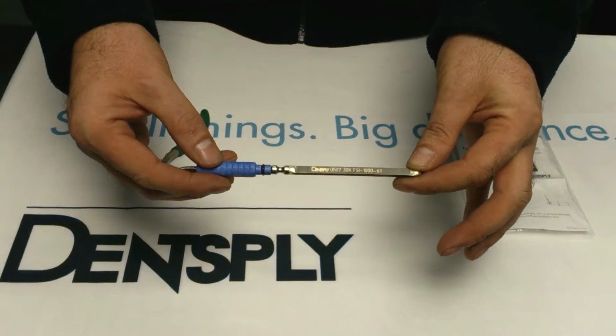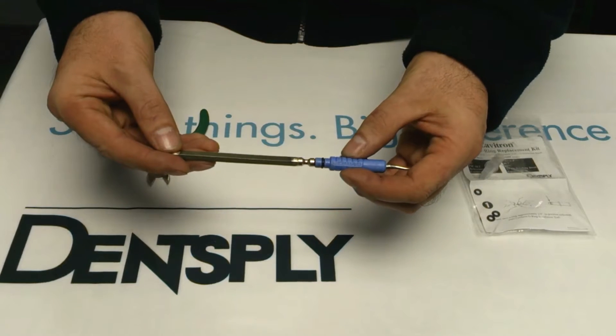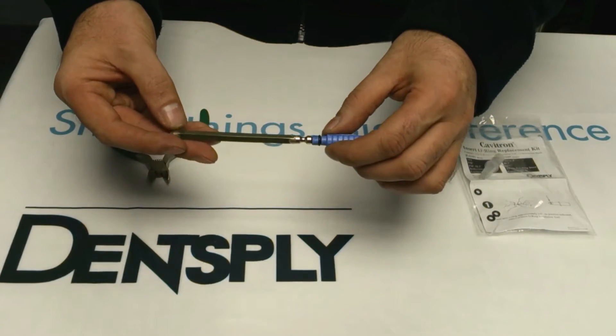This is a Cavitron FSI 1000 insert and it has a black sealing o-ring which one holds the insert in the handpiece and two provides a watertight seal.